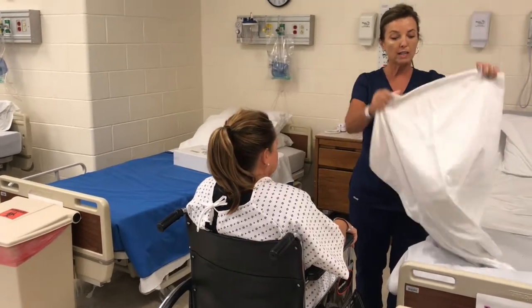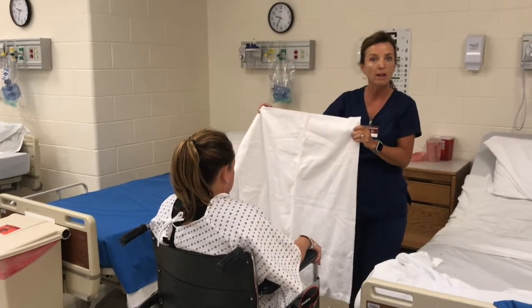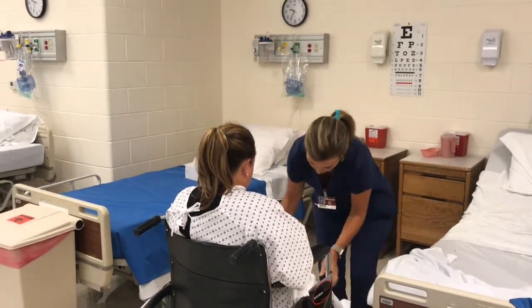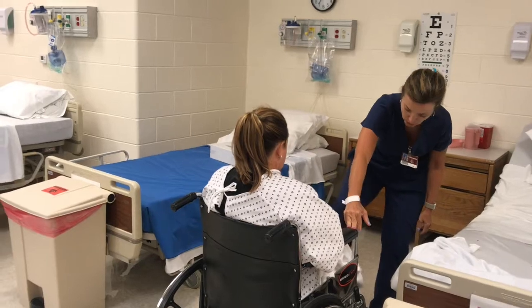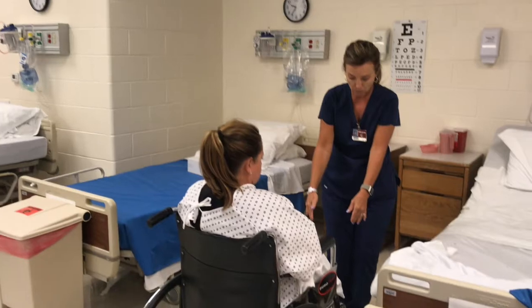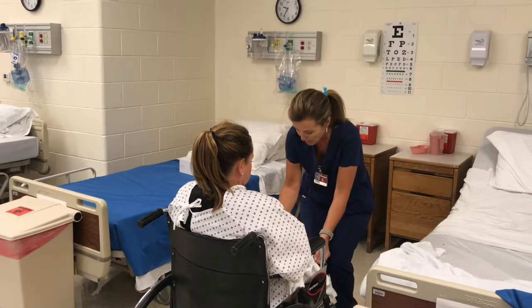Before you leave the room, you're going to need to cover up your patient and provide for some privacy. These little hospital gowns are short and you don't want their rear end hanging out for everybody in the hospital to see. So lower your footrests — I usually use my feet so I don't have to touch them. You might have to assist your elderly patients putting their feet up on the footrest, and if you do, that's okay, just help them with that.